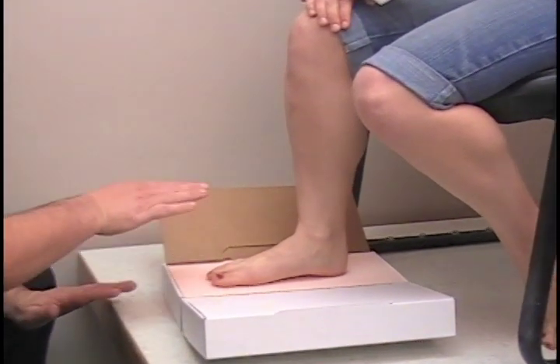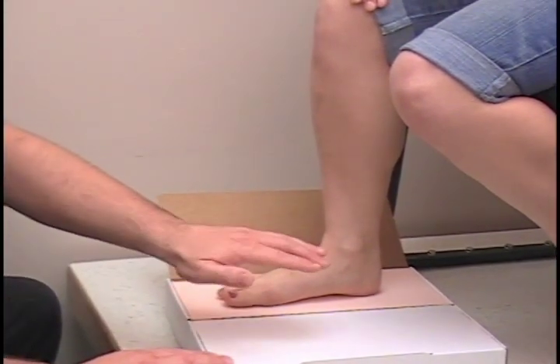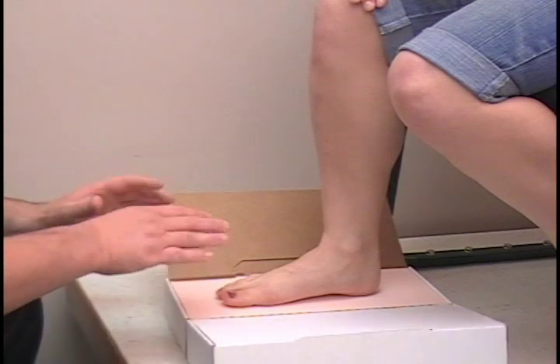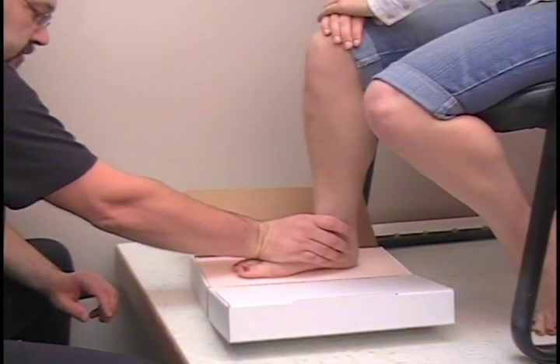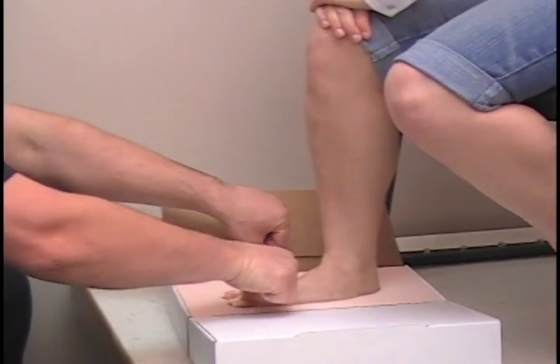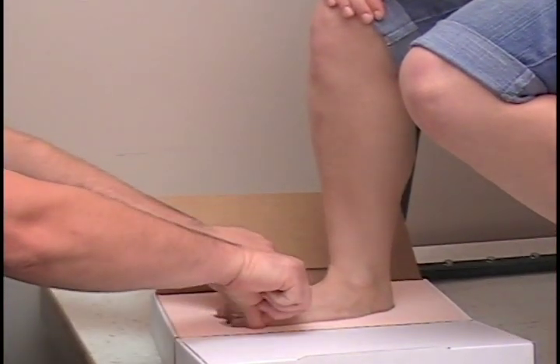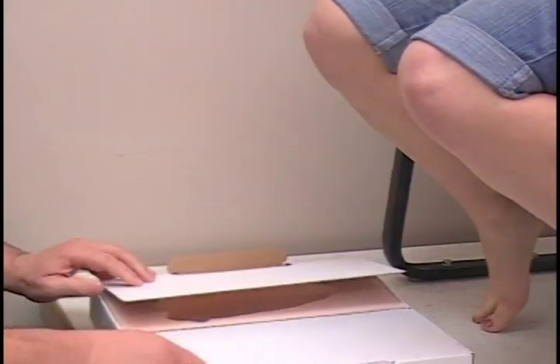You don't want to go all the way down. You want to go about three quarters of the way down. If you go all the way down in the foam, your arch will collapse when it hits the bottom. So you want to keep it just about three quarters of the way down in the foam. Count of three — one, two, three. Push. We will push the toes down real good. And pick your foot up for me. That's one down.